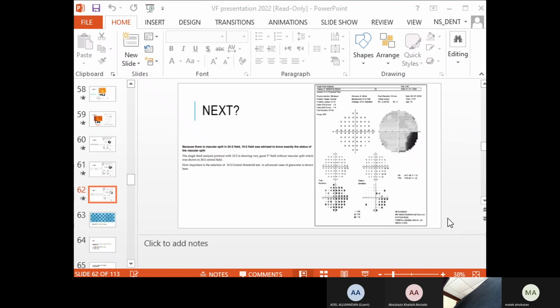And next, where do you want to go? Go to the glaucoma hemifield test. And how to comment? Mean deviation is -3, which is considered minor. PSD is 2.4. What's the normal for pattern standard deviation? Around 0. More than 0 is not normal. Zero is normal, because if the visual field shape is normal, it should be normal. If there are any scotomas or irregularity of the shape of the visual field, it will be positive.